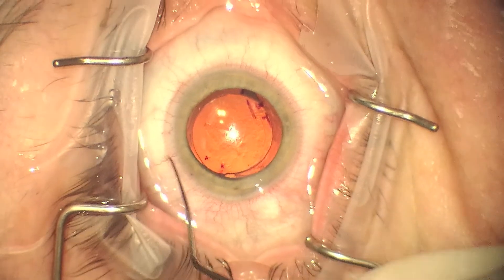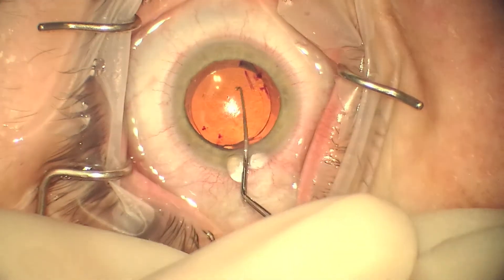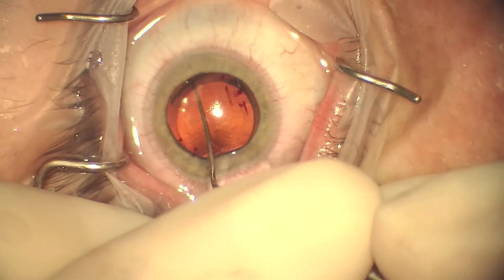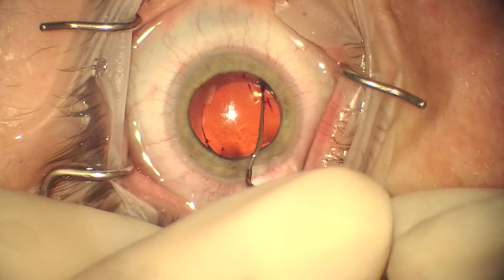We go through the original incision and insert viscoelastic to inflate the capsular bag. It's nice to use the original incision because you're not inducing any new surgically induced astigmatism.